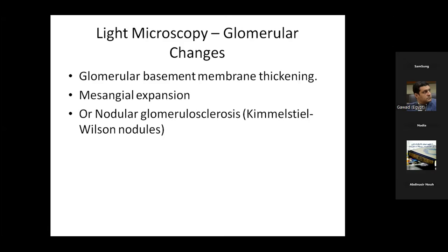As I said, the patient may not be known as diabetic, or there may be another atypical presentation of increased serum creatinine or abrupt or marked proteinuria that does not go with his clinical situation. So under light microscope, and let me add another thing.